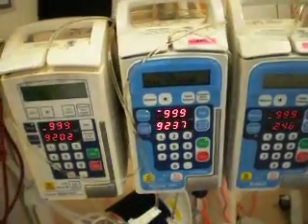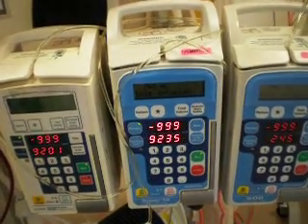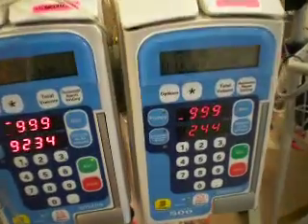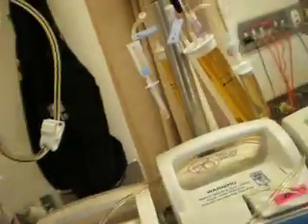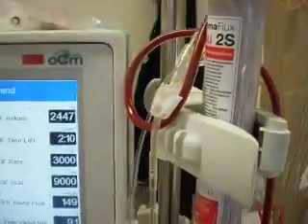Then all three lines are put into the infusion pumps and you can see that we actually infuse back at a rate of almost three liters per hour. Towards the other end of this infusion pump, the three lines are connected to one octopus line.